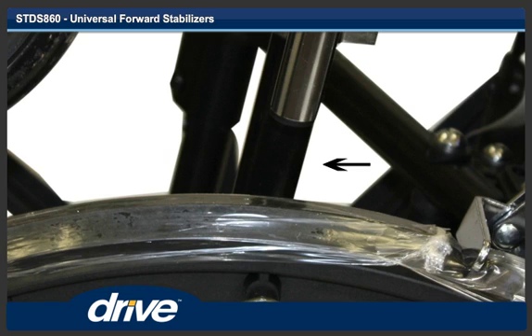Step 6. Turn the wheelchair upright and verify that the rear of the front anti-tipper is not touching the rear wheel. If the front anti-tipper is touching the rear wheel, move the front anti-tipper forward.